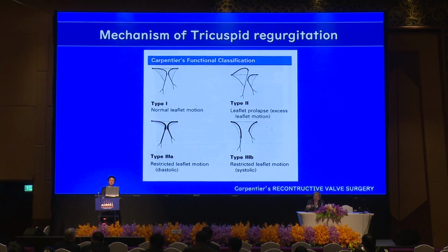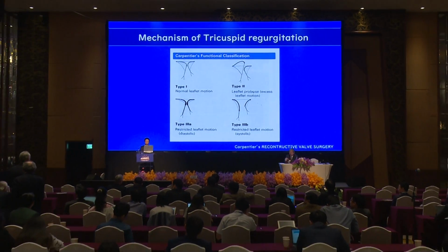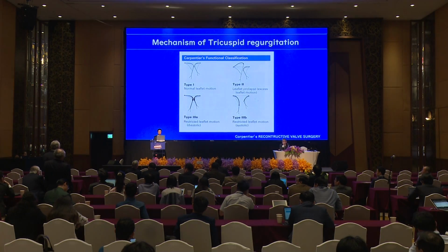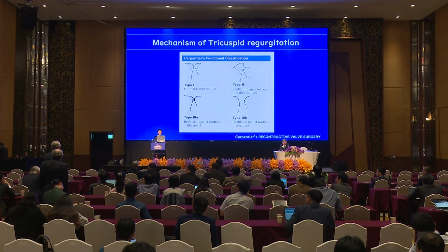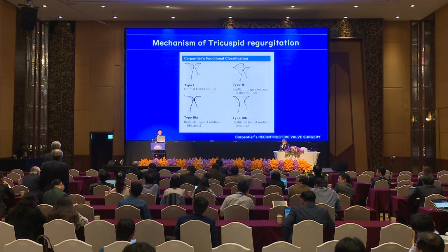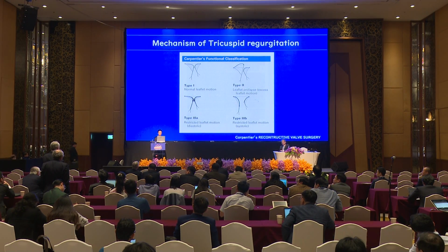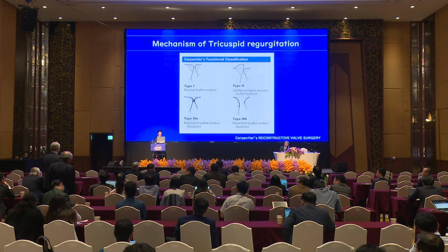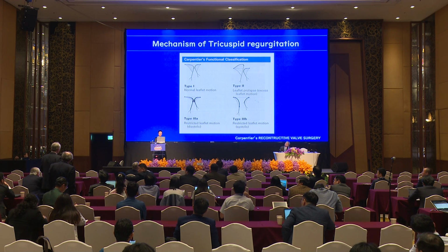Yes, please. Thank you for a very nice presentation. We have no experience with the thin Gore-Tex for the tricuspid valve, but it's certainly very attractive. Since many of these patients are reoperations and the autologous pericardium is thickened, it would be useful. Do you have any experience with this for endocarditis?